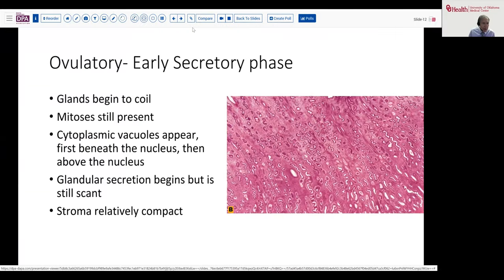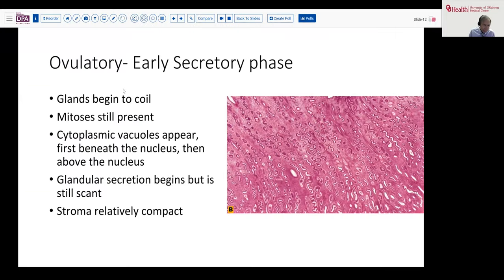When we move into the secretory or ovulatory phase, these glands begin to get a little more coiled. You will still see mitoses. By early secretory phase — meaning around day 16 to 18 — cytoplasmic vacuoles become present first beneath the nucleus and then migrating above the nucleus, as this will be the origin for the glandular secretion. In the early stages, the secretion is still scant because it's still accumulating within the cell, and the stroma will look relatively similar to that of the proliferative phase.